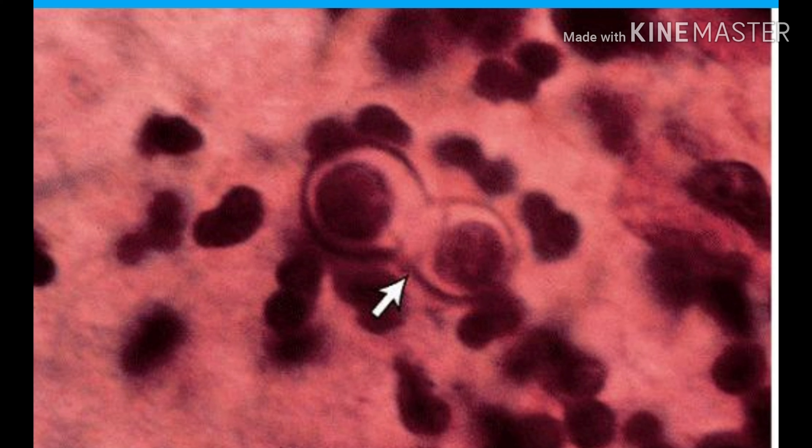Here you can see the broad-based buds of Blastomyces, and the endemic location where Blastomyces is prevalent is eastern or central US or the Great Lakes. Other findings associated with Blastomyces are verrucous skin lesions, pneumonia, and osteomyelitis which presents with bone pain.